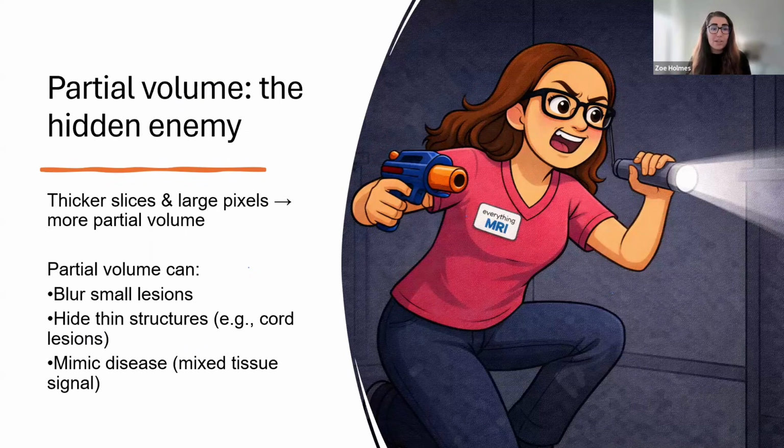So practical recommendations if you're getting partial voluming artifacts: for high stakes, small structure questions like metastatic disease, looking for small mets, or microadenomas in the pituitary, protect that resolution and earn back your signal to noise ratio with things like really good coil positioning.